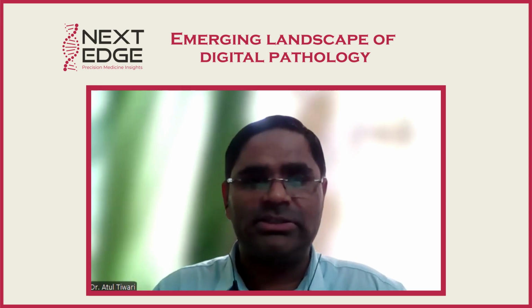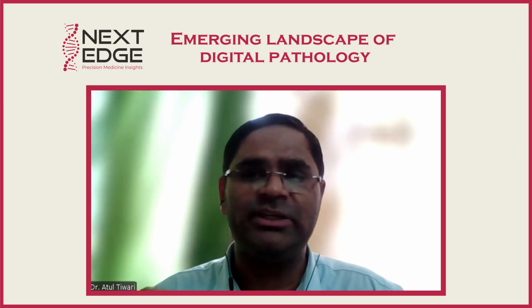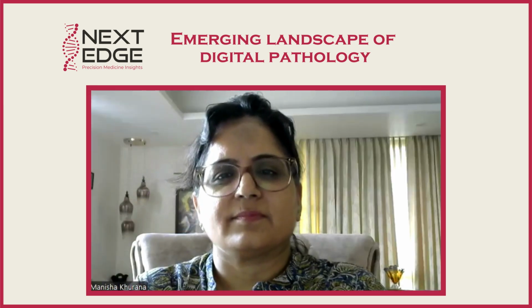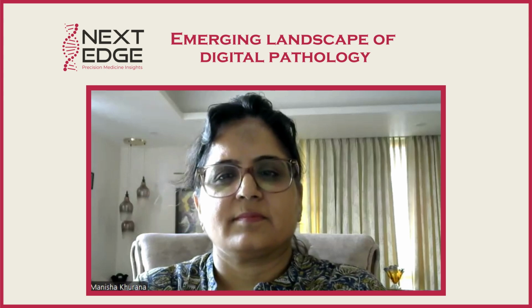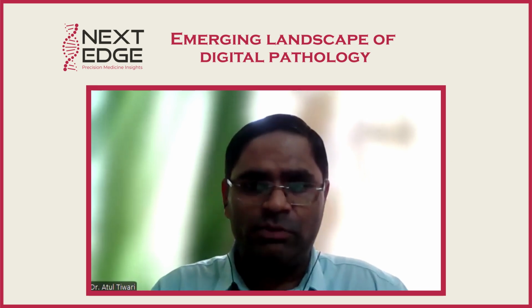In the same case, in pathology, radiology, ophthalmology, dermatology, all the branches where images are dealt with, we are training the machine first: okay, this is a leukemic cell, this is a neutrophil, this is the stromal part, this is a fibrous septa. That's how we train it.